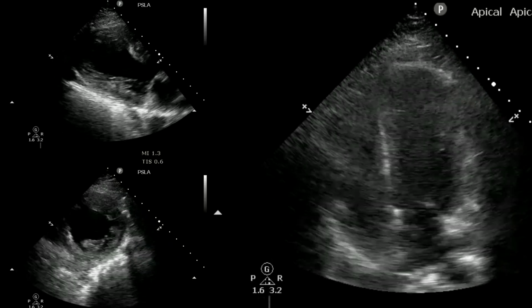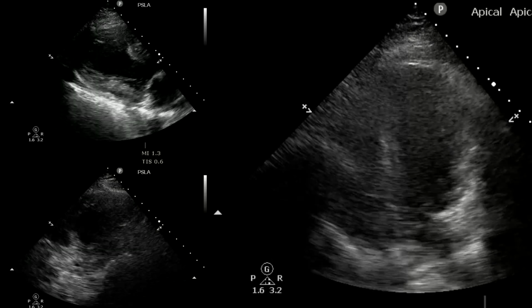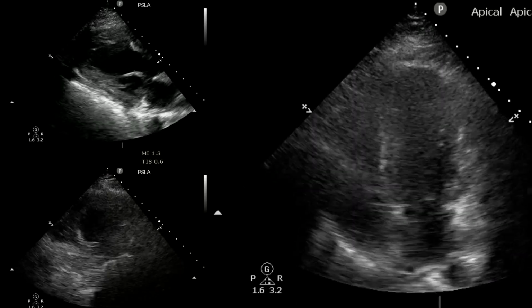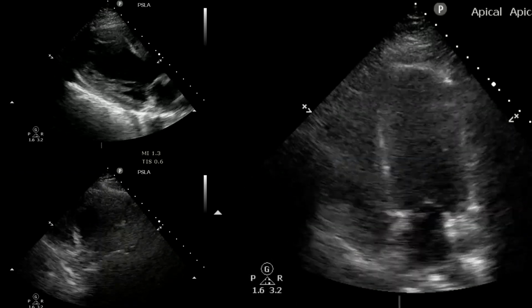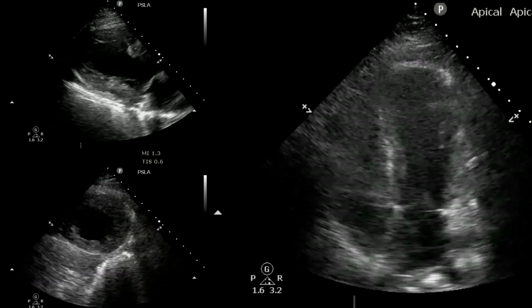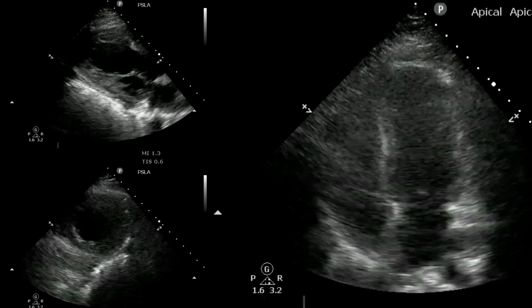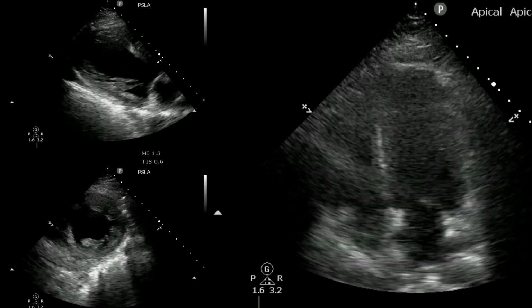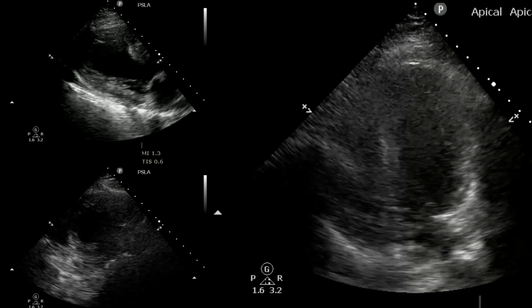And since regional wall motion abnormalities aren't uniform, they're regional. They follow a vascular territory. Depending on which angle you cut through the heart, you may actually catch that abnormality or you may not catch it, and those two different slices will give you two very different numbers for your fractional shortening. So you can see the parasternal long and the parasternal short, and how those stunned walls on that lateral portion versus the moving walls in the septal portion, at least in the parasternal short, can really affect that fractional shortening depending on where you put your caliper. And so those are a couple of the pitfalls.